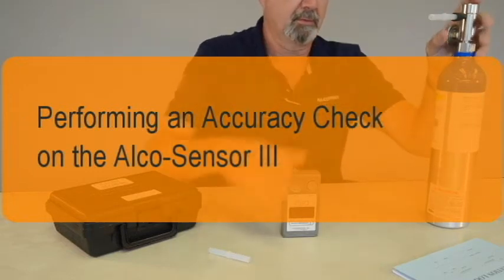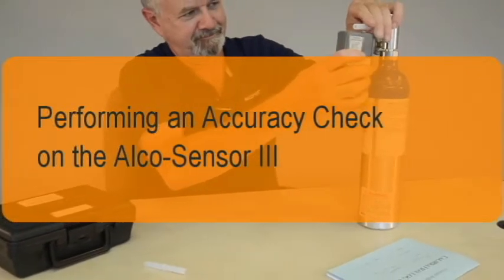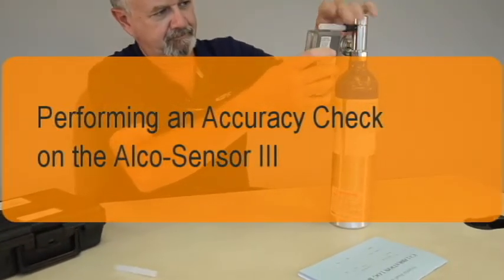This brief video describes the steps for performing an accuracy check on the Alkosensor 3 breath alcohol instrument using a dry gas standard.